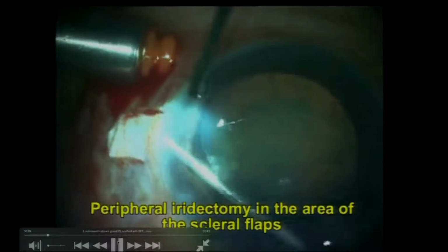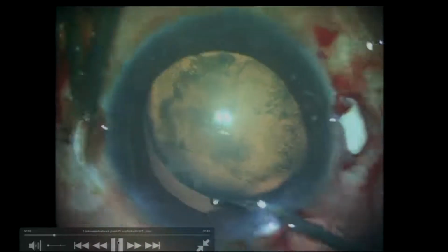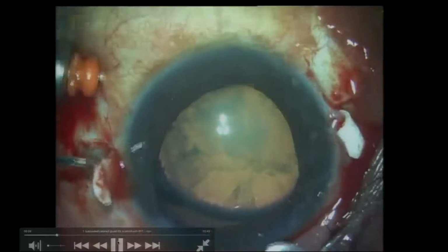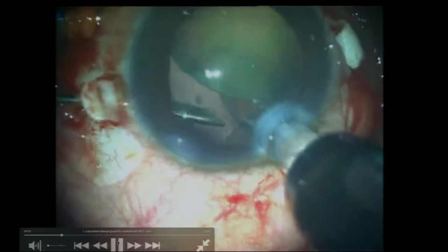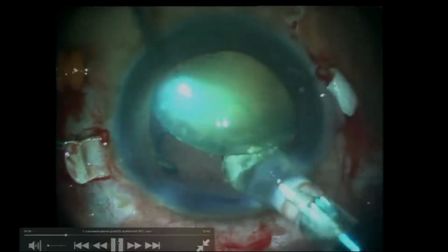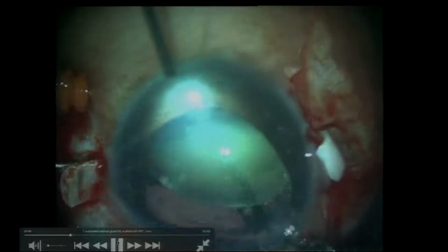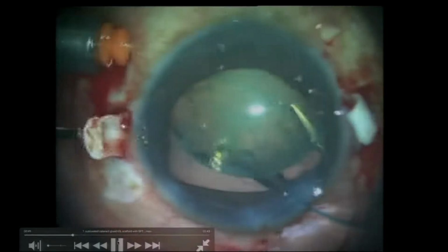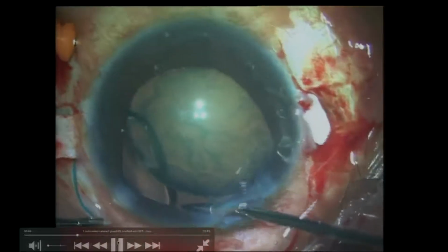Again, watch here, using a vitrectomy. After doing some vitrectomy under the cataract, of course, so that no vitreous comes in the way. Now you've made your peripheral iridectomy and you've made a sclerotomy under that. Now I'm injecting the lens. Mind you, I've not removed the cataractous lens yet, and I have not even made an opening into the lens because that drops lens matter inside. So I'm pushing my intraocular lens under this cataractous lens.